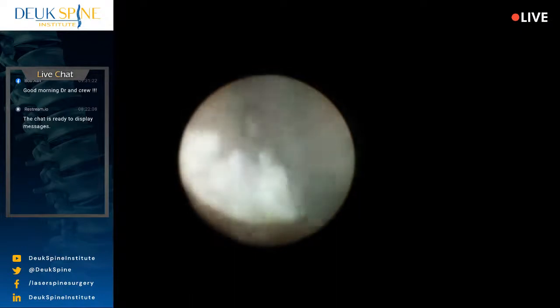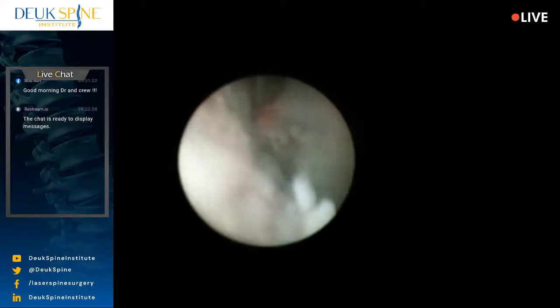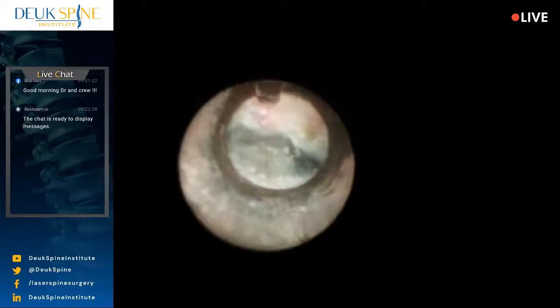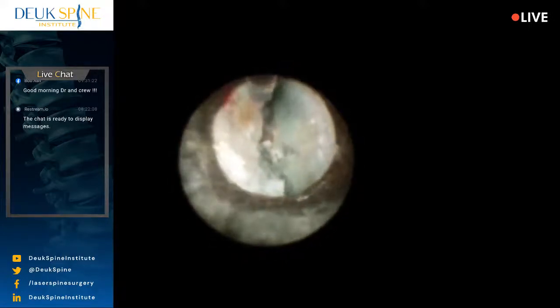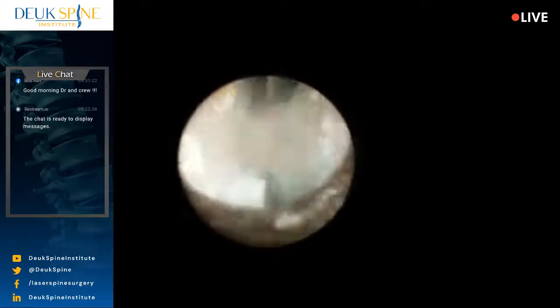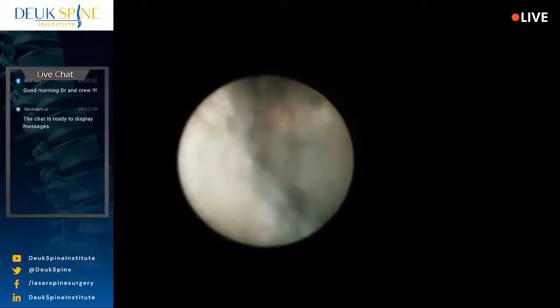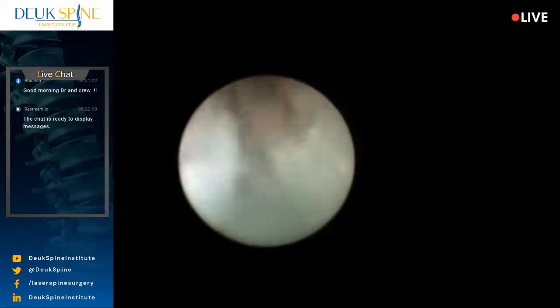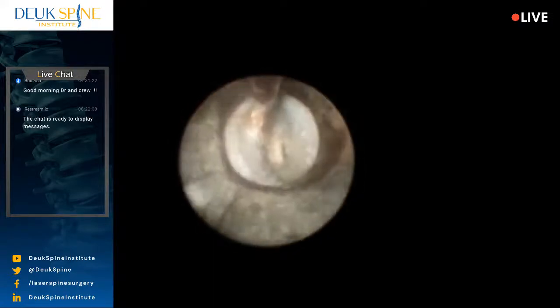So, back down here is where the herniation is. And it's pretty grungy in terms of arthritis creates a reaction in the bone and in the ligaments and in the tendons and in the capsule. Basically, the body's response to chronic inflammation is to form this abnormal tissue, and this abnormal tissue can press on nerves and it can be very painful. So that's what we're here to remove, is this abnormal tissue.